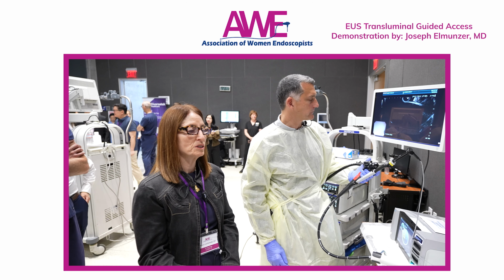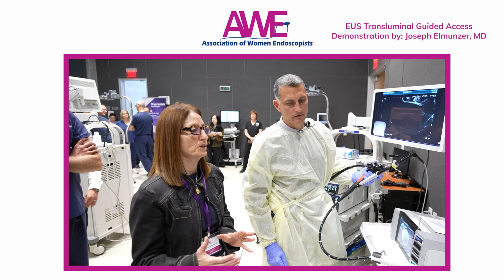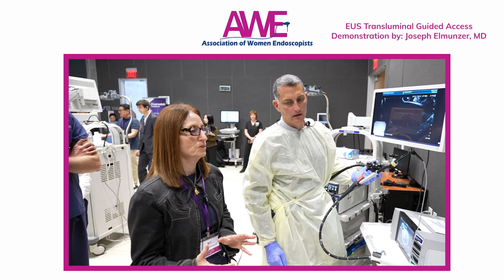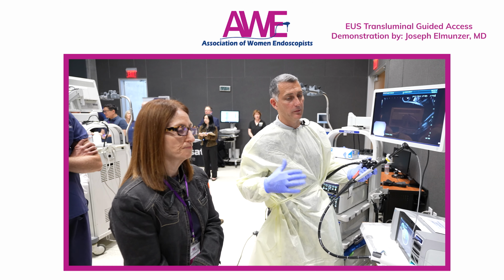And then the extraluminal structure that we're entering, we also want to have a distance that's adequate for the stent to be deployed into as well. Yeah, absolutely. Again, you need that working space because the nose cone is going to move forward and potentially push you back if it's up against the contralateral wall. And so you have to be really thoughtful about that.